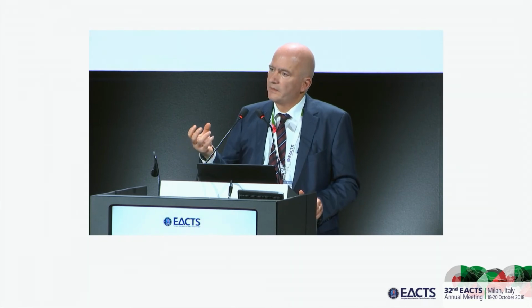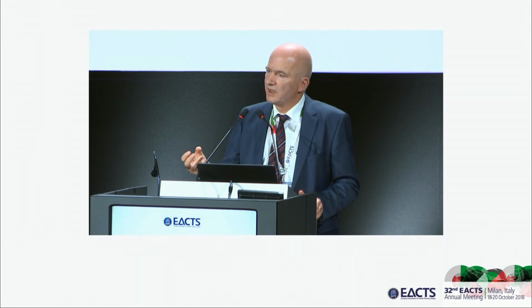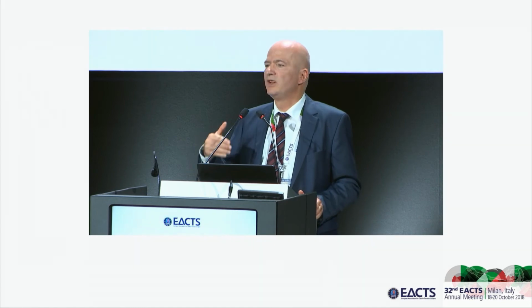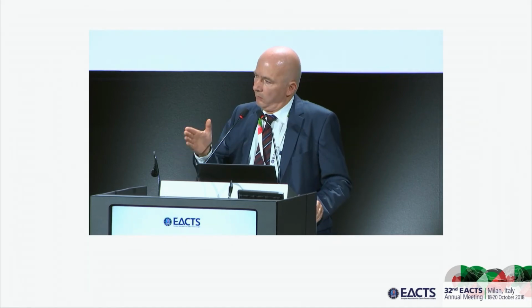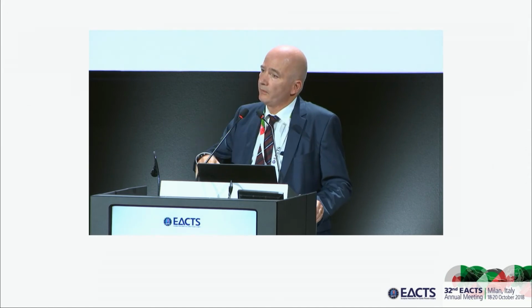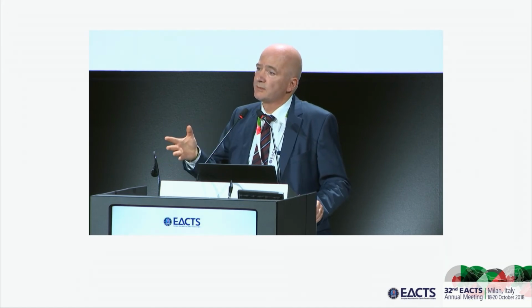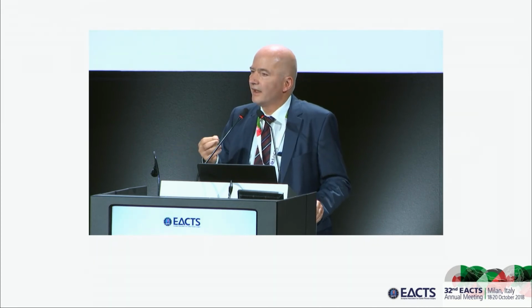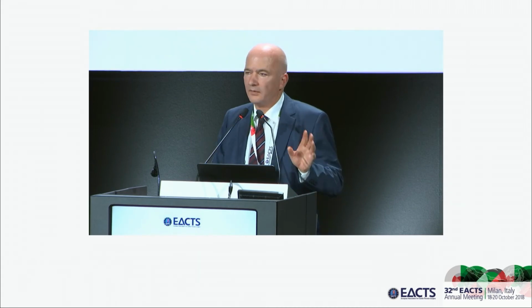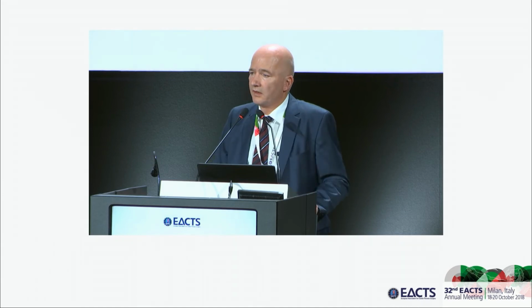Now, these dynamic changes we can assess much better using 3D echo than with a CT, unless we do an EKG-gated cardiac CT scan, where we use radiation throughout the whole cycle, and then radiation exposure becomes relevant. So in effect, I think 3D echo, and this is why I was very happy to hear Michel with the first lecture before the break, is probably the best tool that we can use for imaging and decision making.